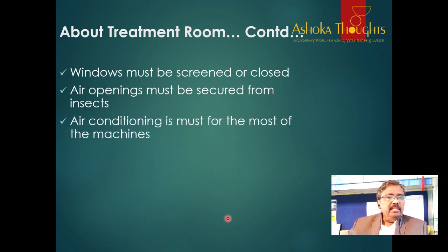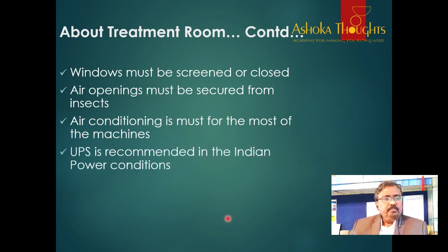Air conditioning is a must for most of the machines. The operating temperature is about 20 to 35 degrees centigrade. If the temperature goes above 35 or 40 degrees, the machine may not work. That's why air conditioning is a must for most of the machines. An uninterrupted power supply, that is UPS, is recommended in Indian power conditions.